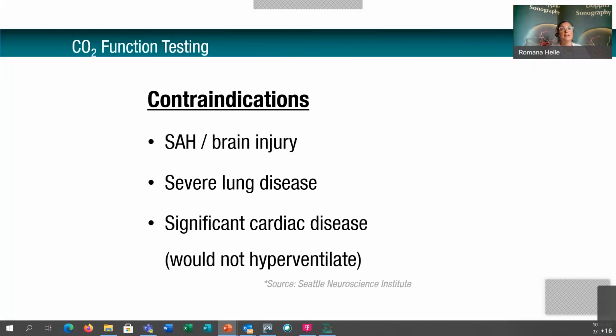Of course, there are also some contraindications, and later on you will see that we are showing you 5 test procedures. In the past, historically, there have been many different test procedures, with different access, trying to look for the reserve capacity. The reason is that depending on the patient, it's not always possible to use only one of these test procedures.